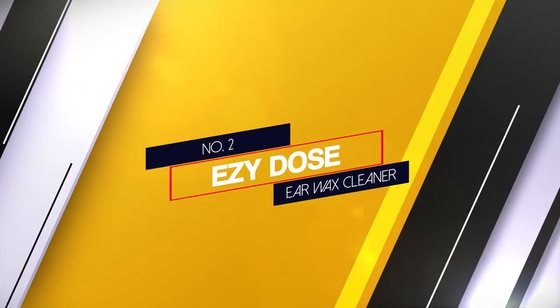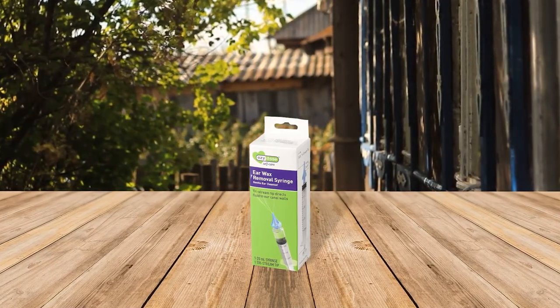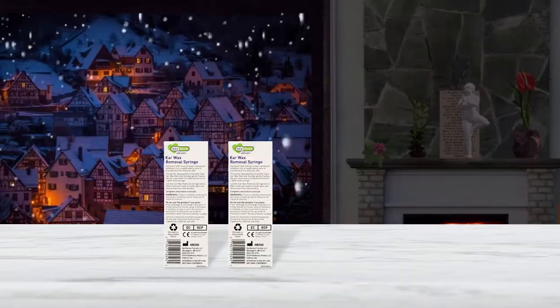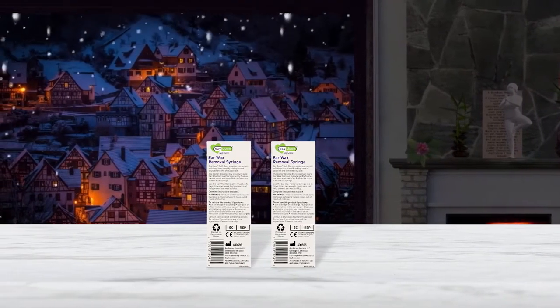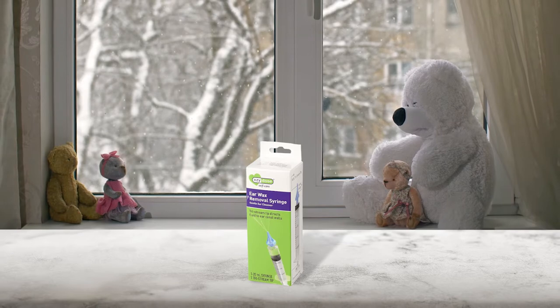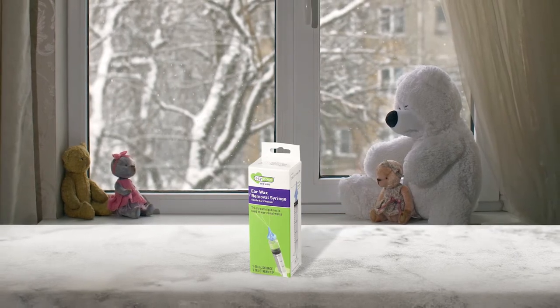Number 2: Easy Dose Ear Wax Cleaner. While bulb syringes that come with many earwax remover kits are easy to use, many people find them difficult to aim directly at the earwax. With its slender tip, this syringe is designed to point directly towards the back of the ear where earwax builds up and becomes impacted. For best results, use warm water to fill the syringe and tilt your head when using it. The flared design prevents over-insertion and cleans the ear effortlessly.